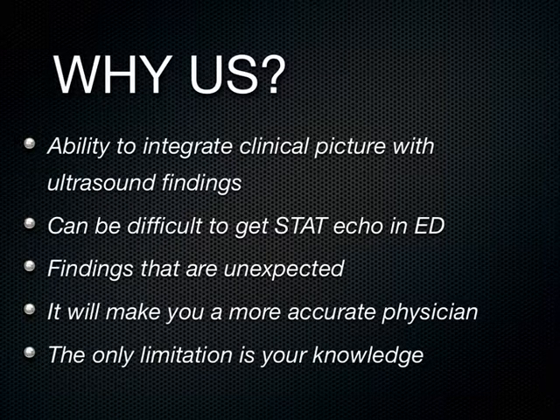We had a case of this just recently, in a patient who came in, was this 2 days ago? Yeah. Who had fatigue. I just reviewed it today during QA. The students were looking at the gallbladder and other structures, and there's a great ultrasound image of them looking at the gallbladder, but off in the distance towards the bottom of the screen, you can see a big fluid collection with the heart beating in it. Then they focused on the heart, and this was pericardial tamponade, and the patient went to the cath lab and had a pericardiocentesis as a cure for their fatigue.